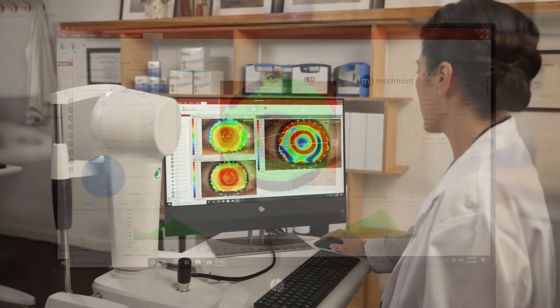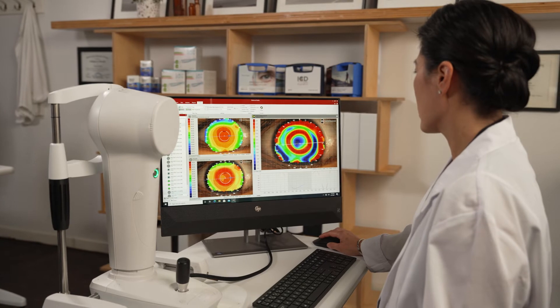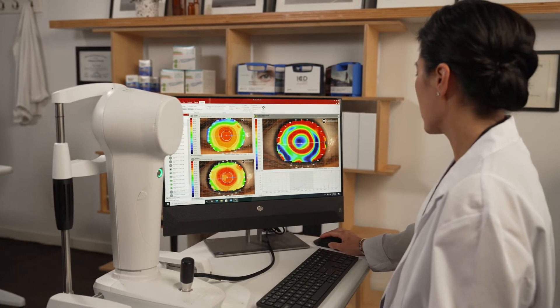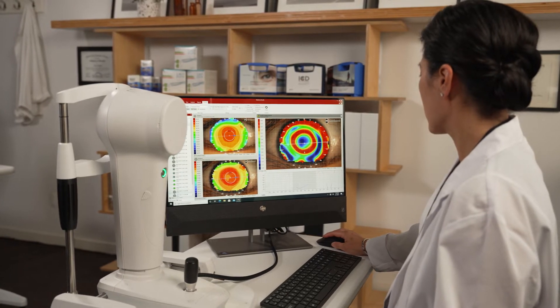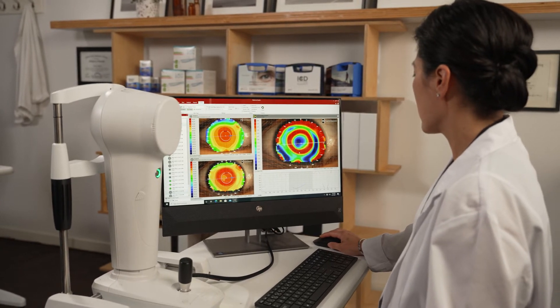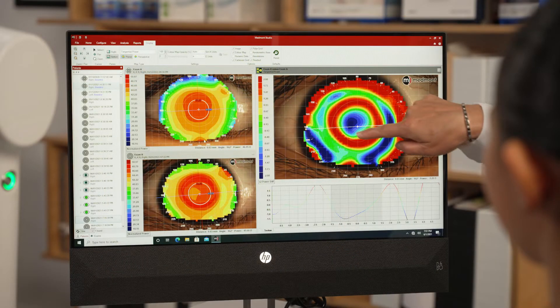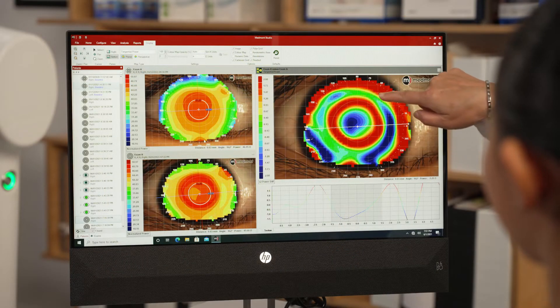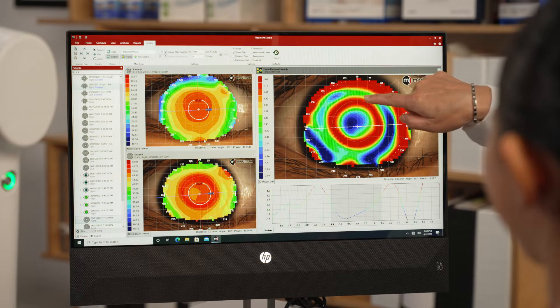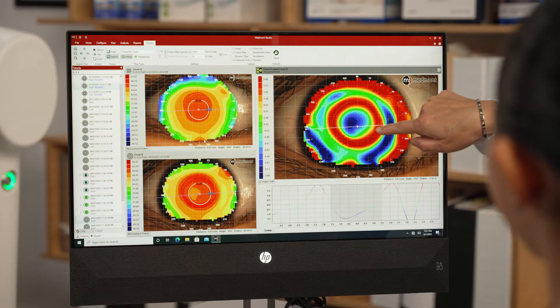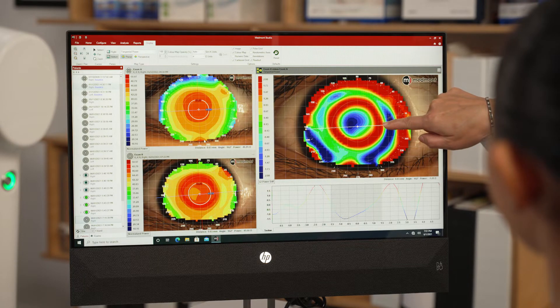In ortho-keratology and myopia control analysis, the Medmont's subtractive maps can be an important tool in your assessment of the outcomes following lens wear.